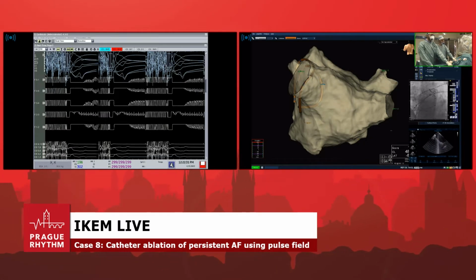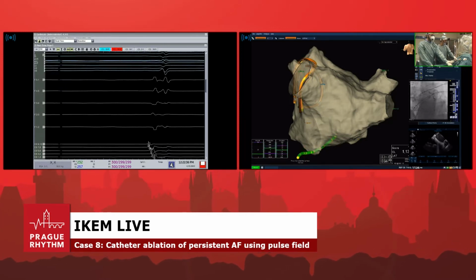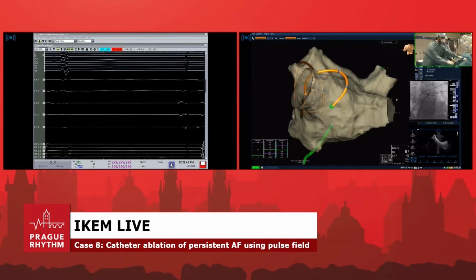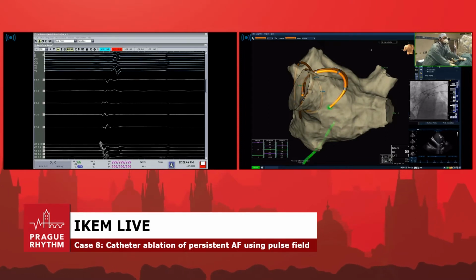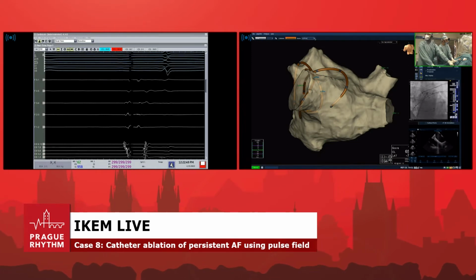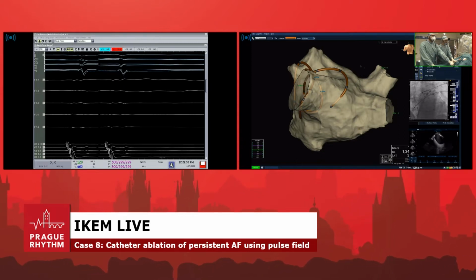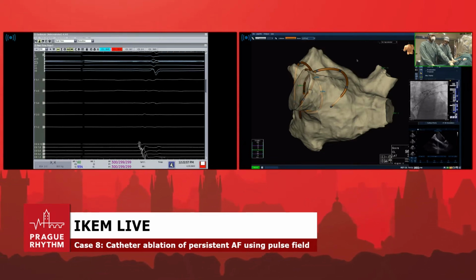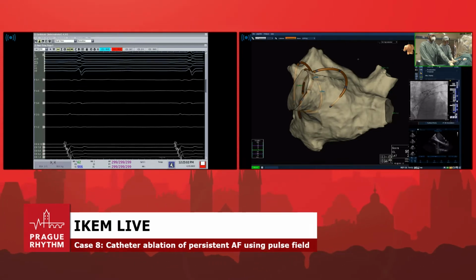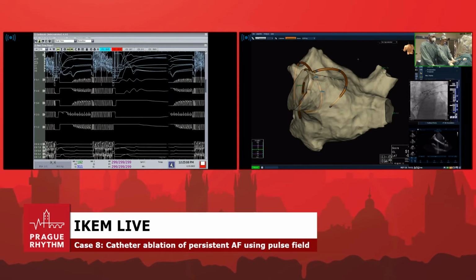Now, this is very important for our strategy of posterior wall ablation. I come back and we deliver what we call an anchor lesion. I rotate and come back here. So this is the LSPV anchor, and you've seen on fluoro that we're having good contact. Go. Observe on fluoro. While having a wire inside, it serves as an anchor lesion and ensures contact with that far structure, especially elongated. LSPV, anchor, pulse 2.